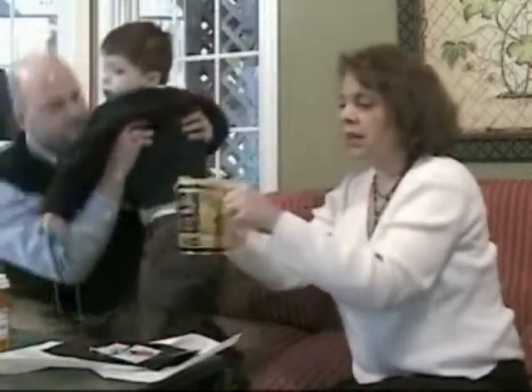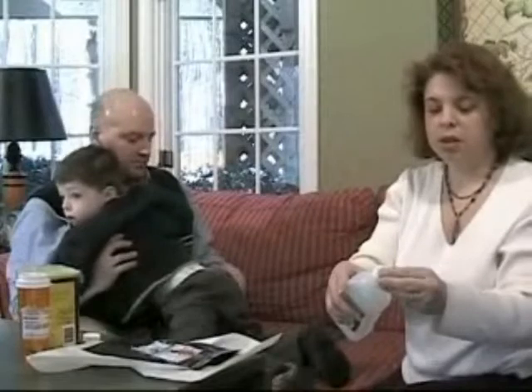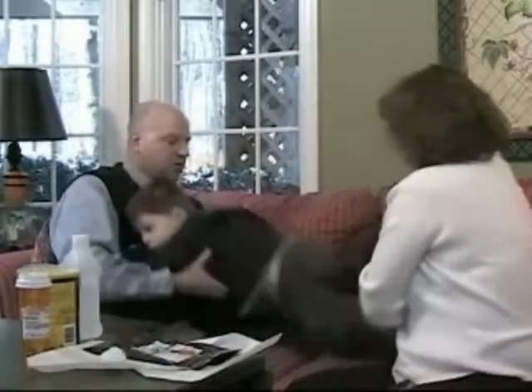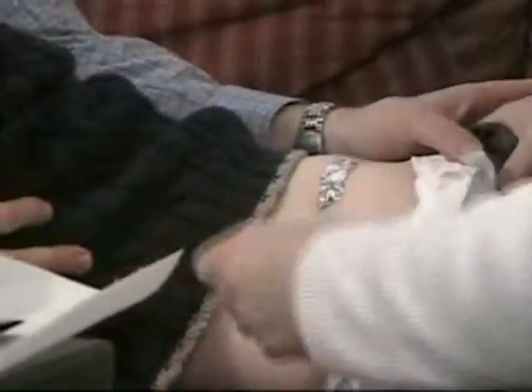Basically all I do, I have a coffee can, I put a hole that's very tightly taped, and I have a hole where I administer the needles. I basically get an alcohol swab, soak the whole one side. Generally speaking, Kevin will go up. I have the cream on. And I want to show you the Band-Aid right there. Basically, before I do it, I peel the Band-Aid away where I see I've administered the cream. I wipe with the alcohol, and then I get ready to administer the shot.